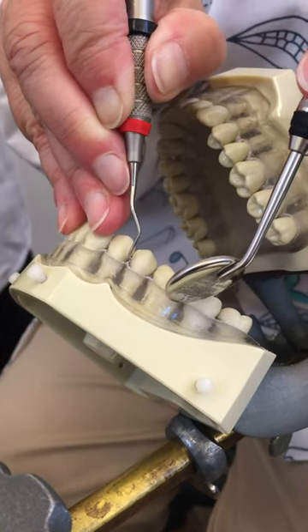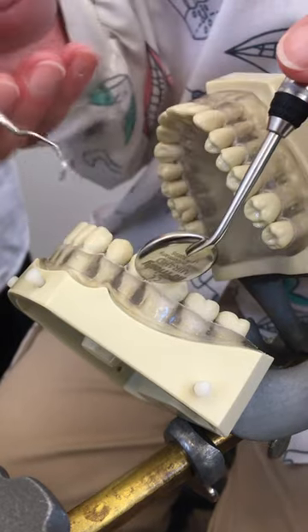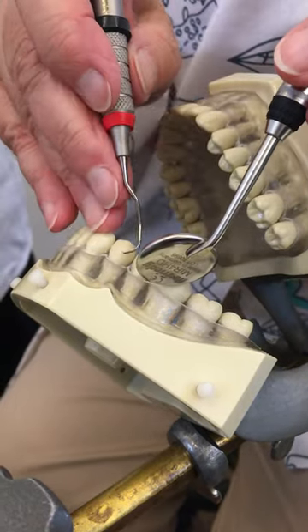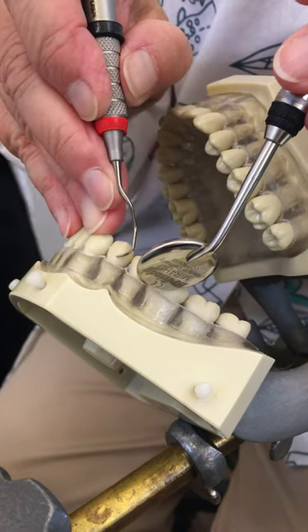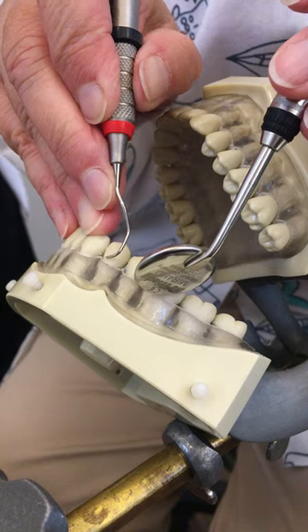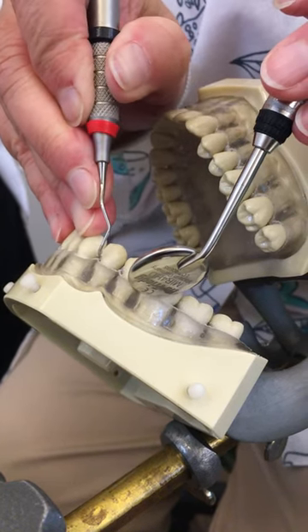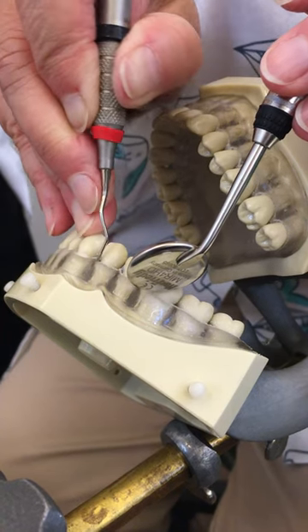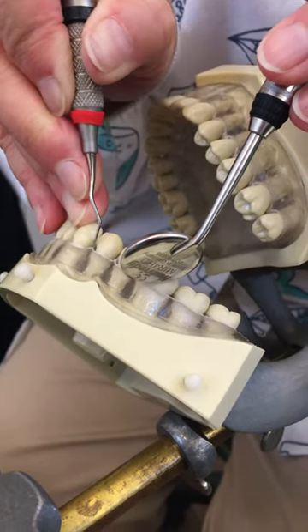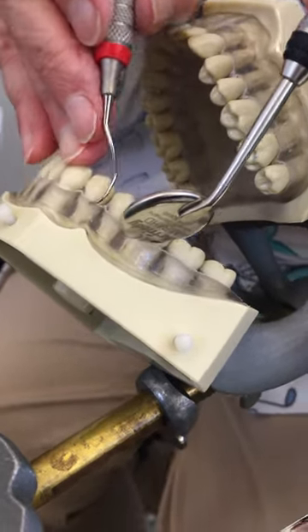Now, if you look closely, you might think that I'm using finger motion. I'm not. As I'm coming up, I'm squeezing the instrument to make sure I have enough pressure, and letting up on my apical stroke, which is my exploratory stroke. But I'm still doing this wrist-forearm motion.